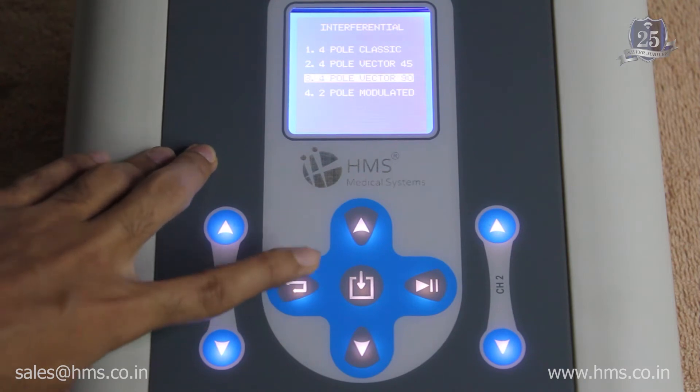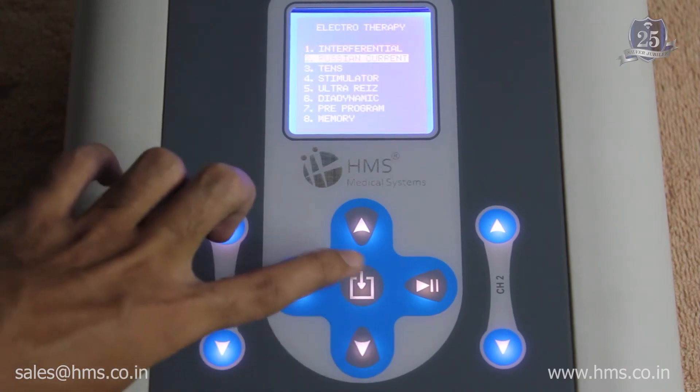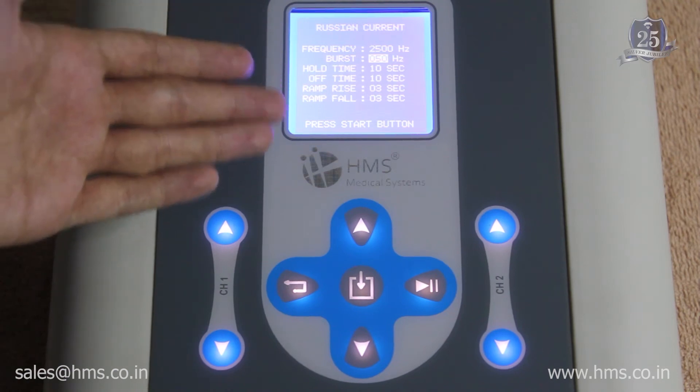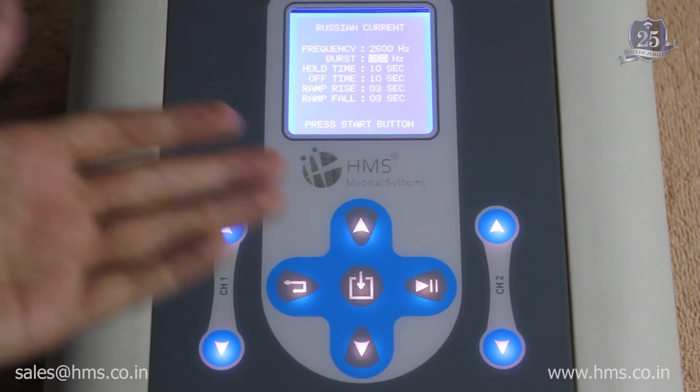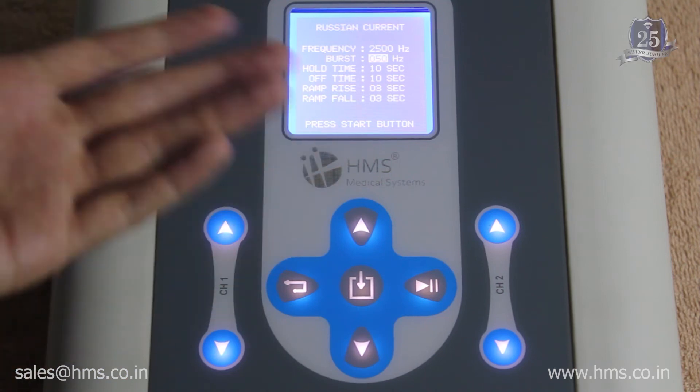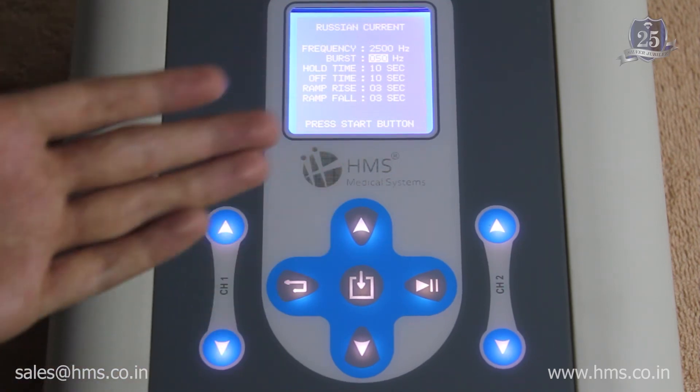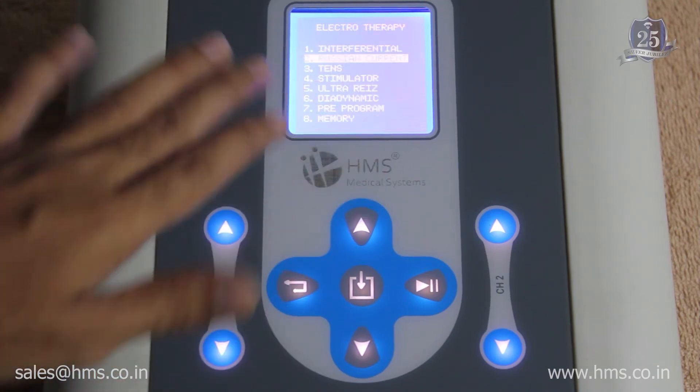Next is the Russian current. In Russian current, you can set a frequency, burst, and hold time according to your needs and then start the treatment. The maximum treatment time you can set is up to 99 minutes.